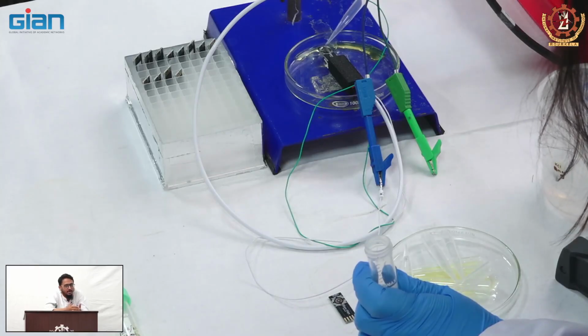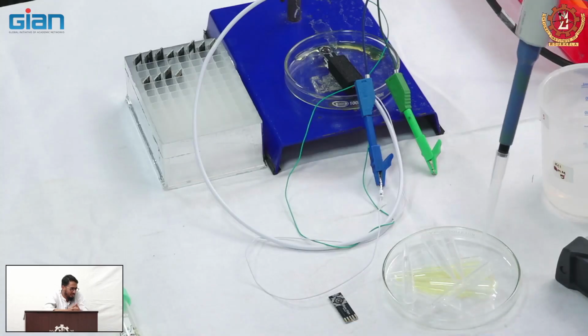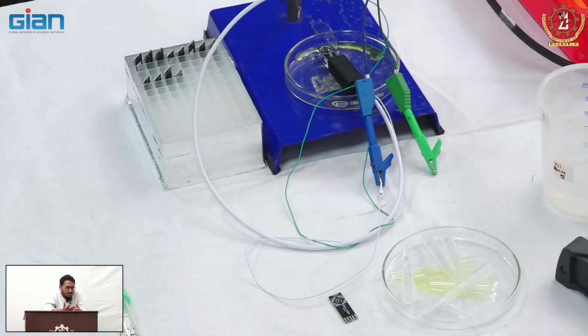The more calibration points you have, the better it is. Just in the interest of time, we are doing it for 3 or 4. The first one is just like a control. If you wish, you can do more. Generally, we would do 5 or 7, and then repeat it 3 times, so we know the standard error and standard deviation. This is now 5 millimolar, right? Correct.